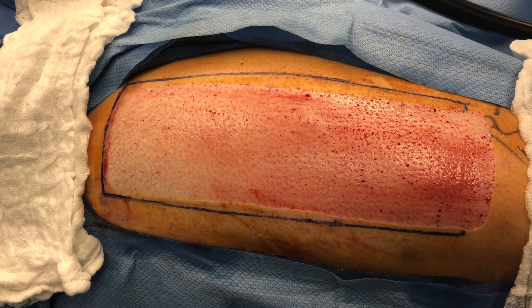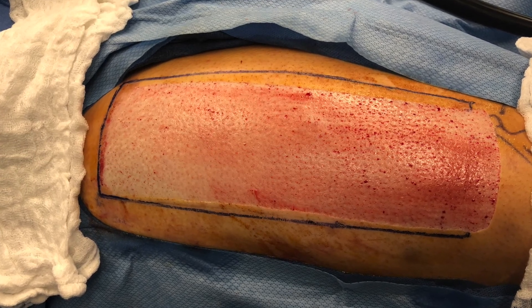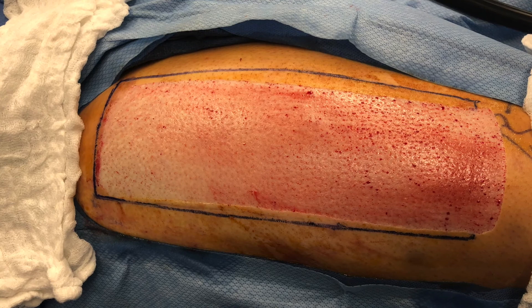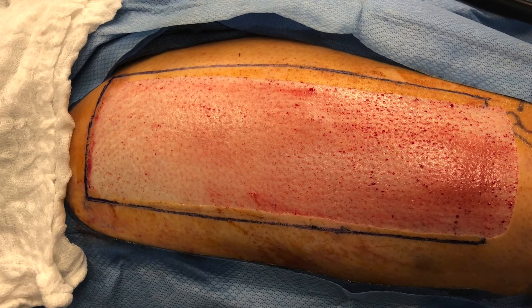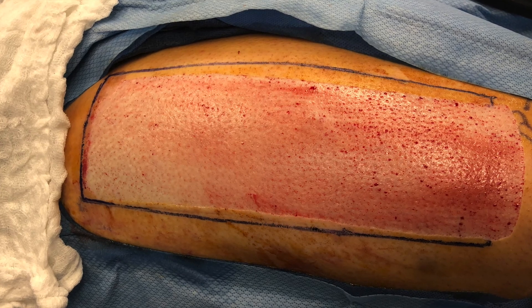I quickly cover this with a telpha dressing soaked in epinephrine with marcaine in order to minimize ongoing blood loss. I later switch this out for a xeriform dressing which I will leave on until this is dry.